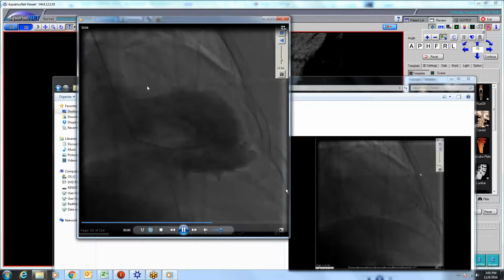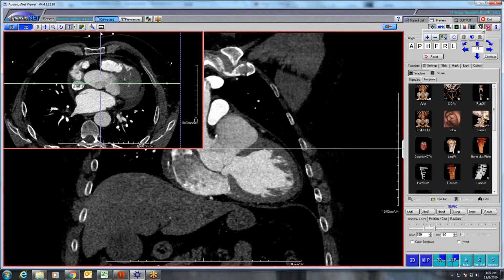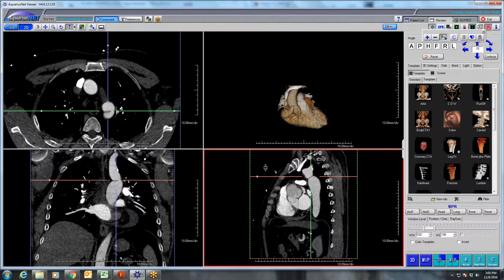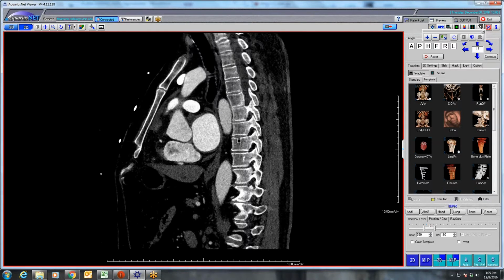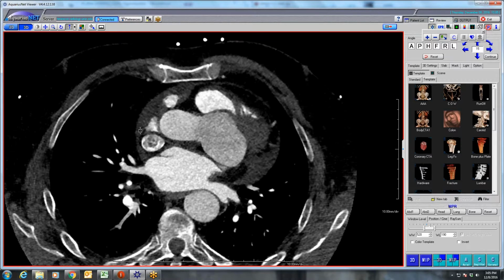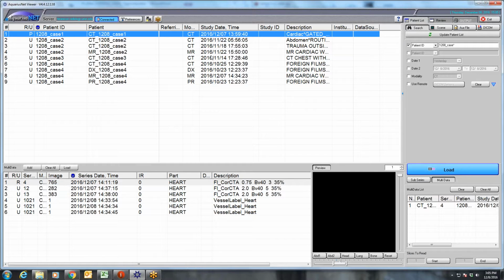slowly starts to fill. And then another interesting finding is he has a bicuspid valve, and associated with that, he has a little coarc. So, don't know what the relationship is between sinus of Valsalva aneurysm and coarc. We obviously know the relationship between bicuspid valve and coarc, but I don't know. I've not seen a sinus of Valsalva aneurysm this big, and the ones I've seen that have been very large usually have decompressed with the VSD, have decompressed into the right ventricle or right atrium. Those are the ones I've seen. So we'll find out. He's going to surgery today. So that was a cool case.